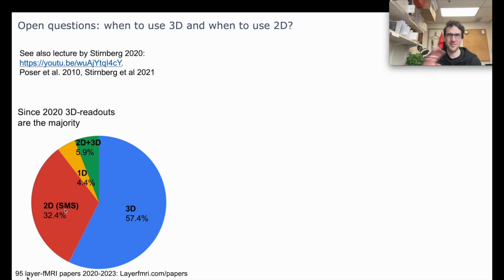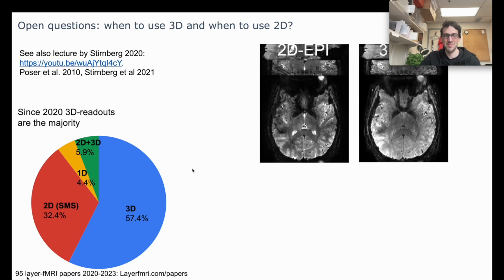And there are a few differences with respect to their sensitivity to artifacts. Maybe most notably, and discussed early in the literature, are things like off-resonance effects or dephasings. Off-resonance effects should theoretically be there in 3D EPI. They are just not as apparent. Very often they average out, though they are still there k-space-based. The second thing is the dephasings, which are sometimes not as severe in 3D EPI because you have the other k-space-based segments that don't have it completely decayed away.